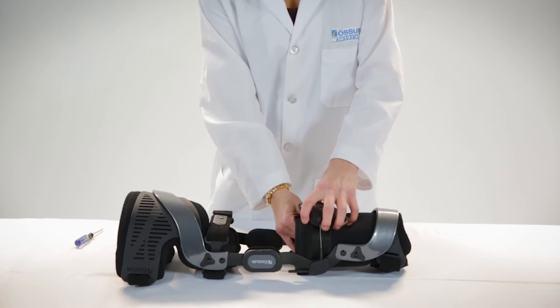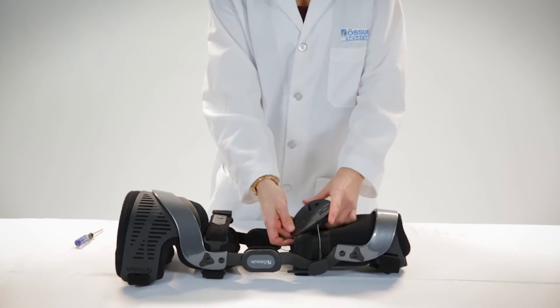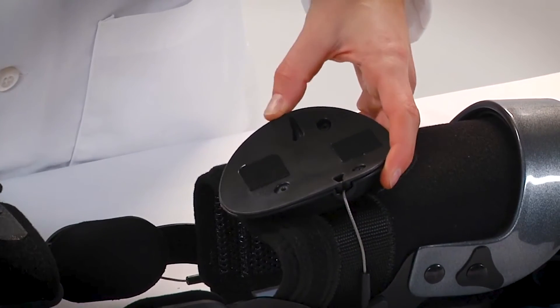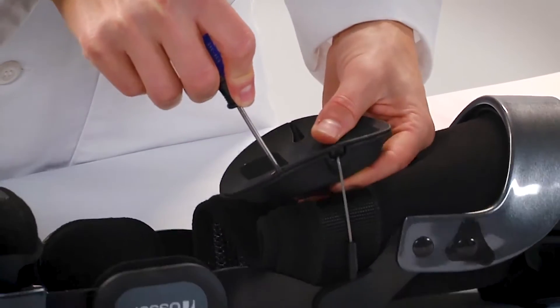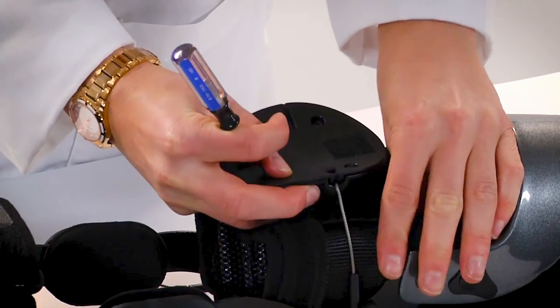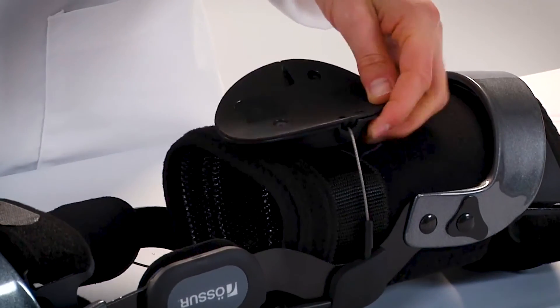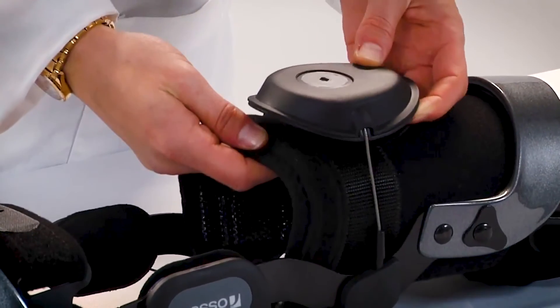Remove the device from the leg and unfasten the DTS from the AMS liner. Turn over the DTS to expose the underside. Insert a pen or screwdriver into the hole in the pawl and apply outward force in the same direction of the arrow to disengage the pawl from the spool. While maintaining the disengaged position of the pawl, pull the cable out of the DTS until the DTS slides freely on the cable. Turn over the DTS and reaffix it in its original position on the AMS liner.